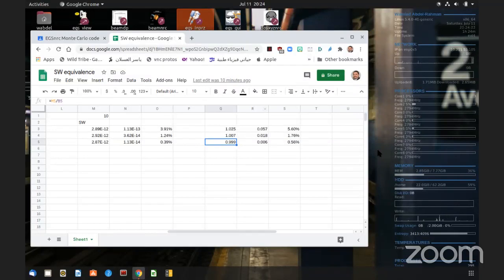Then the problem will be, where is this copper actually placed relative to my point of interest? You could investigate that. For example, if copper is placed 1 centimeter above my point of interest, does that have a different effect than using the same thickness of copper 5 centimeters away? We don't know, because we're not talking just about primary, we're talking also about the scattering. And of course, we're assuming that the copper is infinitely large and so on.